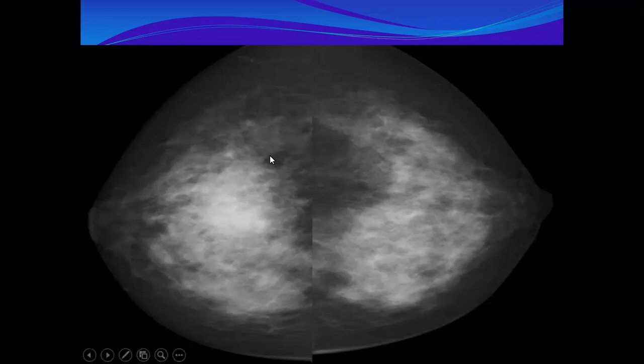Regarding this part of the breast, this half and this half, is the asymmetry here or here? In the CC view, the upper part, the upper half, represents lateral, and the lower half is medial. At the level of the nipple, central. And here, this is anterior, middle, and posterior. So the asymmetry where? Anterior, middle, or posterior?